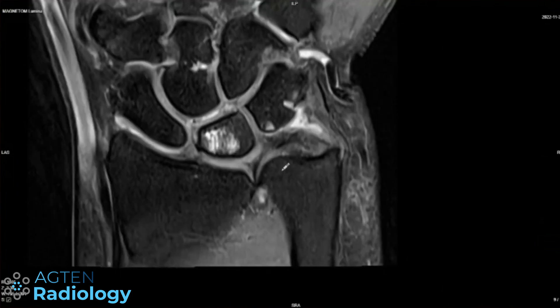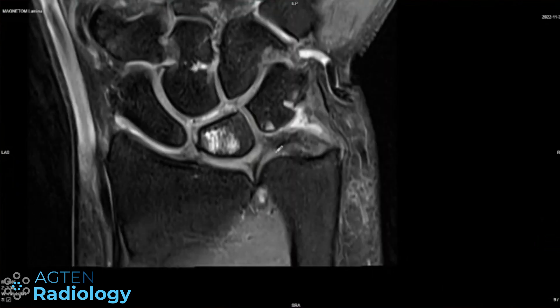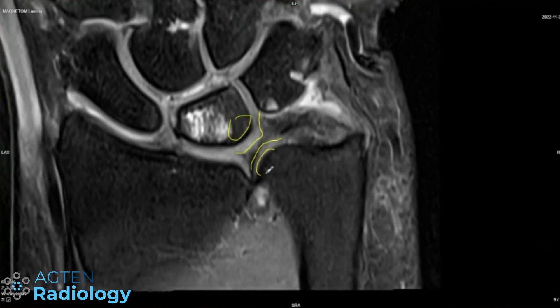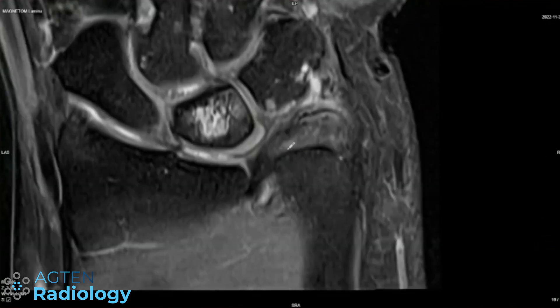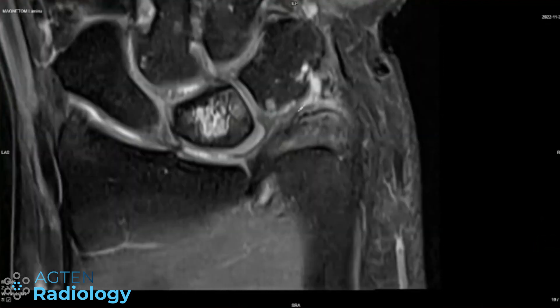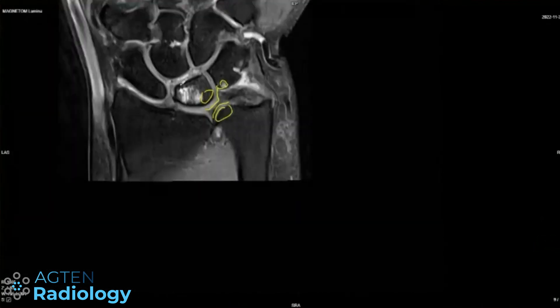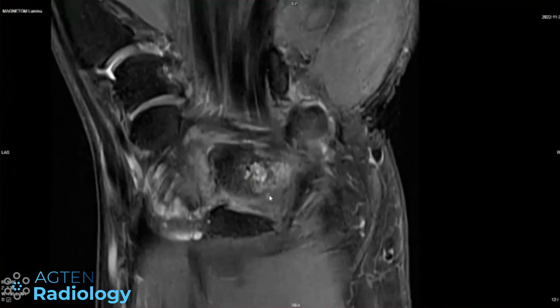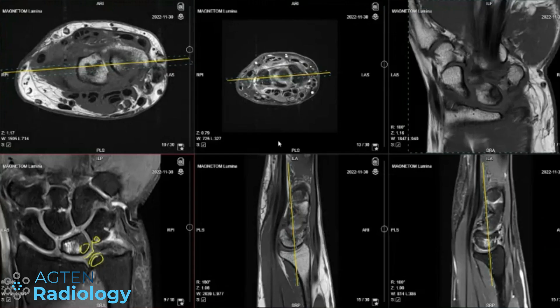The differential then would obviously be ulnar impaction syndrome. But the TFCC is also degenerated — we can have a look at the other sequences. It's not showing normal signal, but the cartilage on the lunate is fine. We don't have any osteoarthritis or contusions in this area where we could just easily make an impaction out of this. There's a bit of a cyst here that might also indicate a mechanical issue. But then when we have cysts, the differentials would also include CPPD, chondrocalcinosis, that kind of stuff.